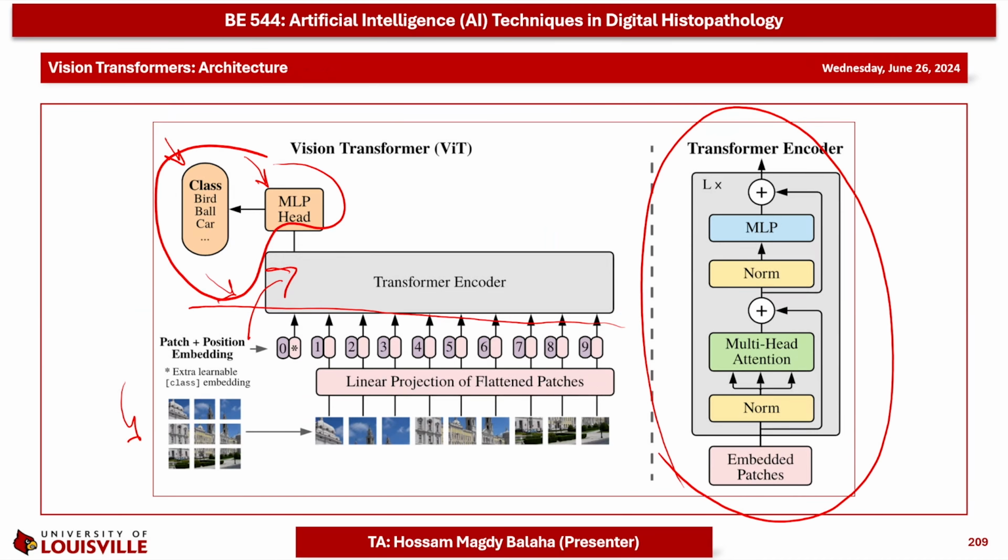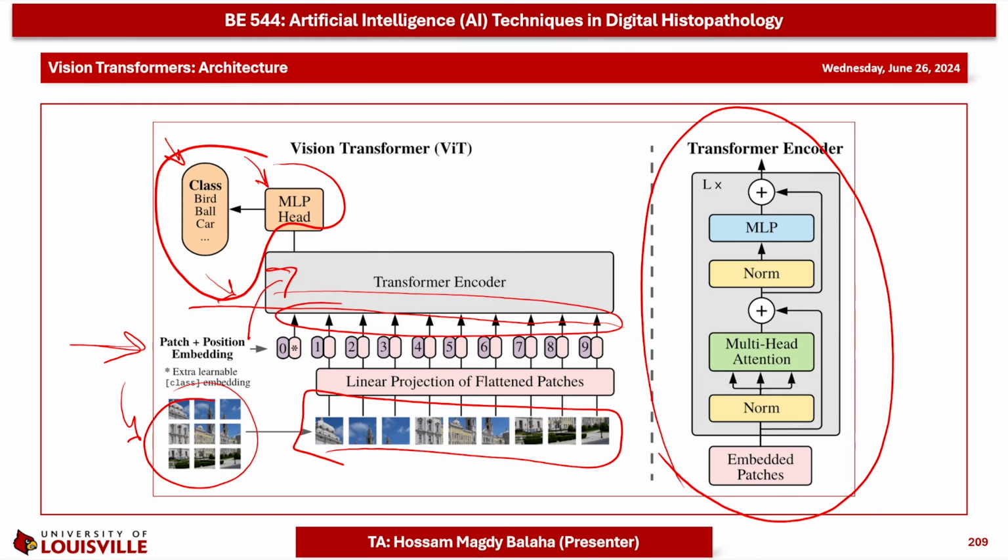Back to the figure again. Now we have an image that's converted into patches that are projected and flattened, and then the position is added and the CLS token is prepended. Then all of that sequence is encoded in a sequential manner using N encoders, and then this is subjected to an MLP head, which will extract the prepended token after being encoded and learn it to represent the output.